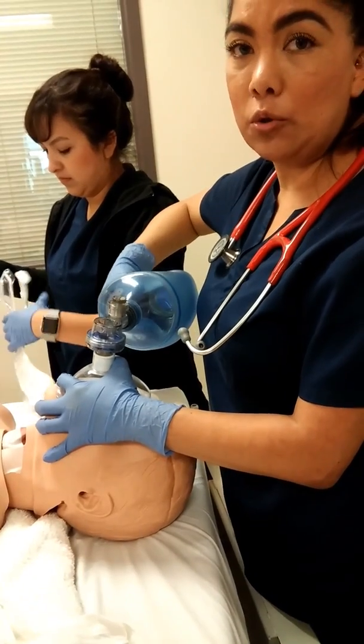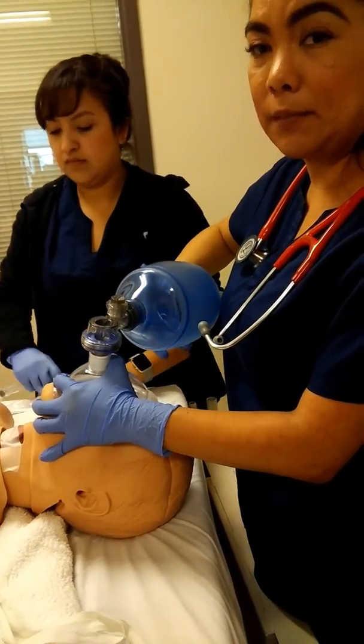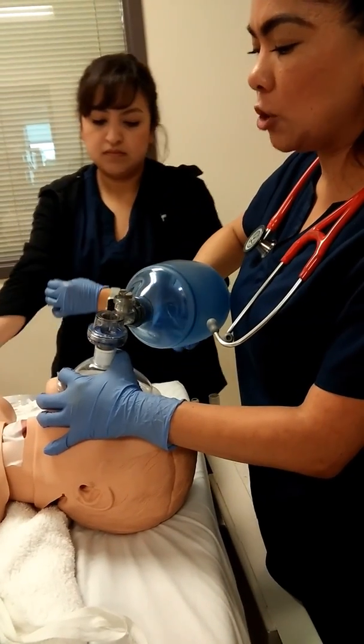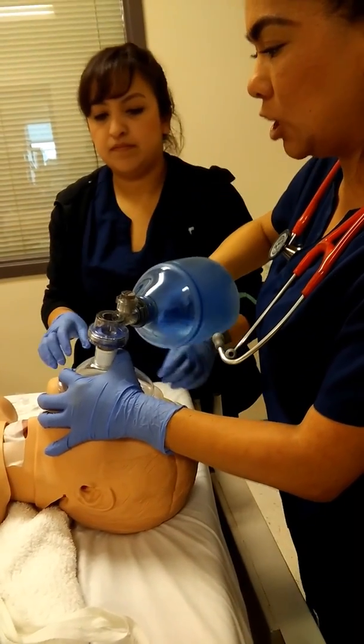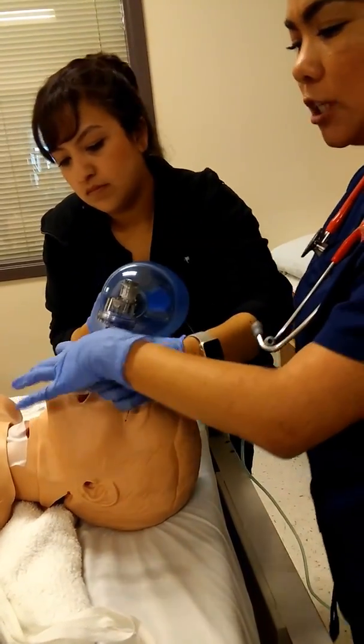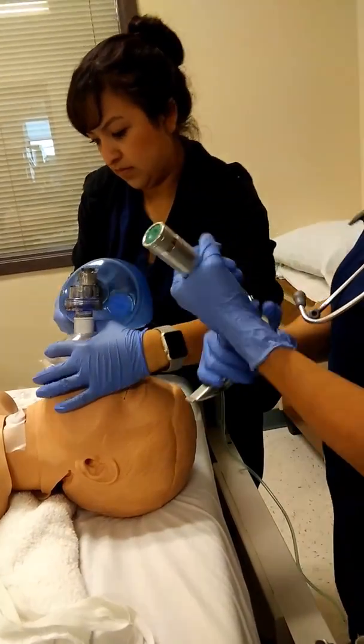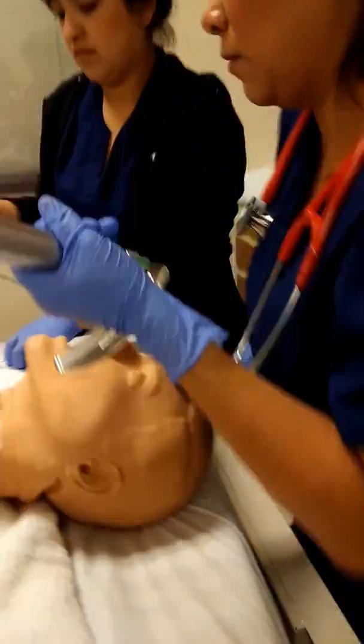So again, we want to oxygenate the patient, and then I'm going to attempt it once again. Okay, so I went ahead and obtained a new tube and provided them with 100% oxygen, and I'm going to reattempt.